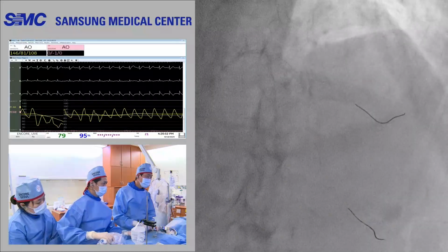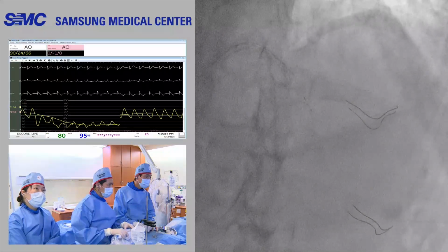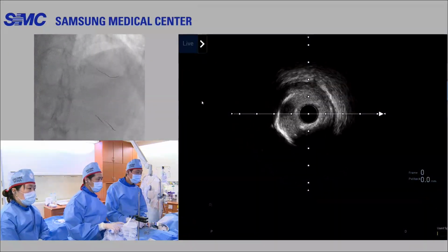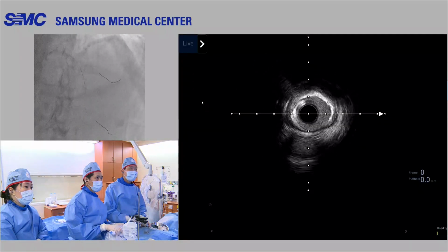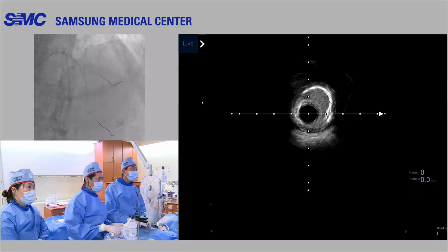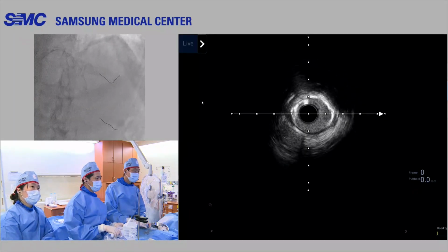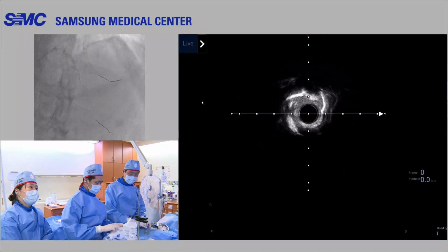Then you are going to IVUS? Yeah, IVUS. Please introduce the IVUS more distally. More distally, really? Yes, that is the reason. How do we identify the real vessel size? Calcification all the way. There is no way to find the real vessel size. Just here. Okay?